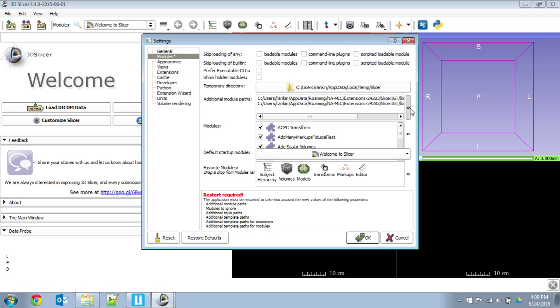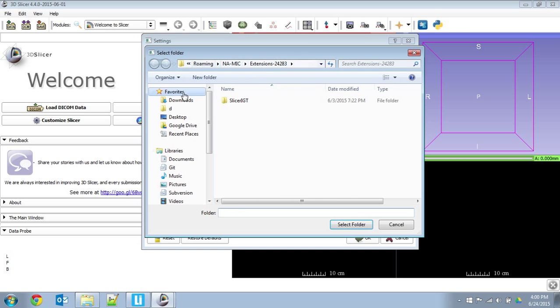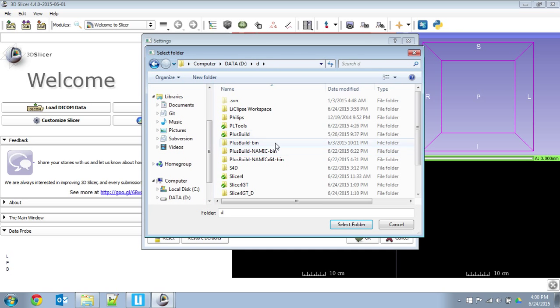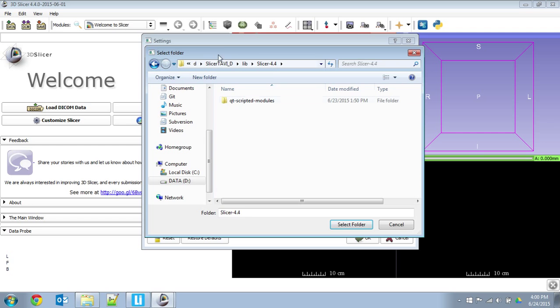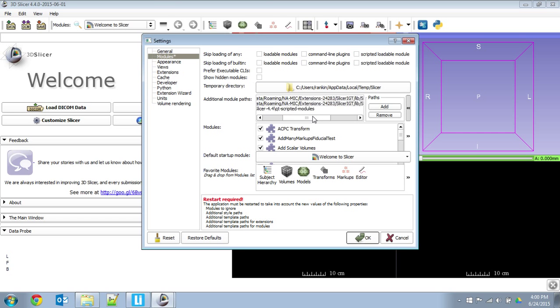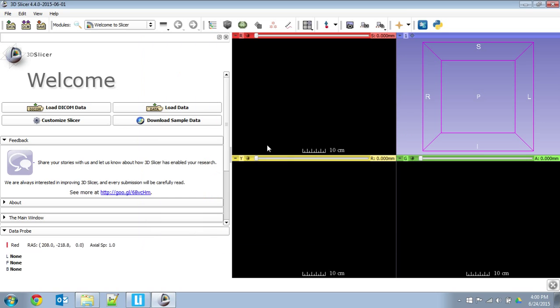So I'm going to add in the path to my files. And this is where I'm choosing the build folder. There, parent folder. So this is great. Now it's going to load any modules it finds in that location. And I'm actually not going to restart. I'm going to kind of cheat a bit.